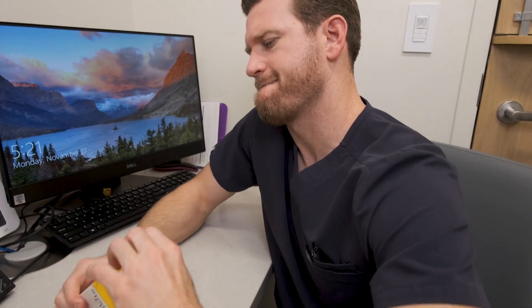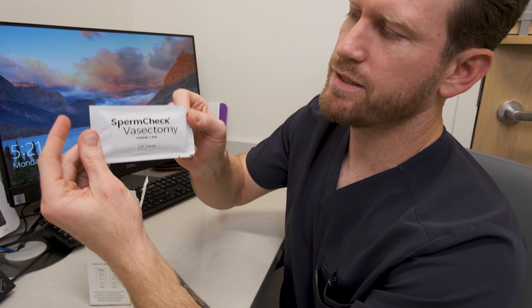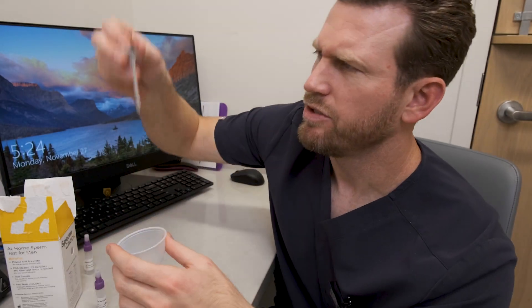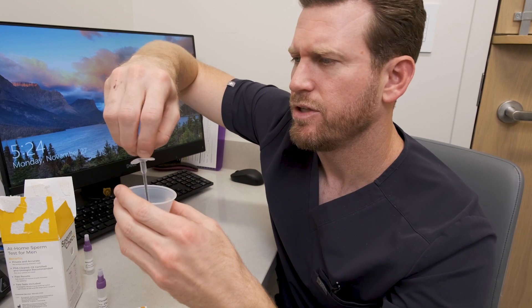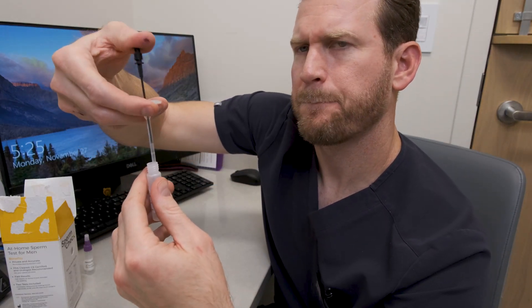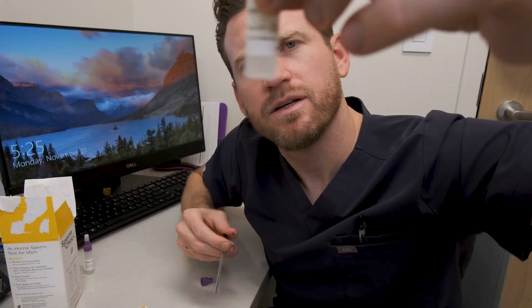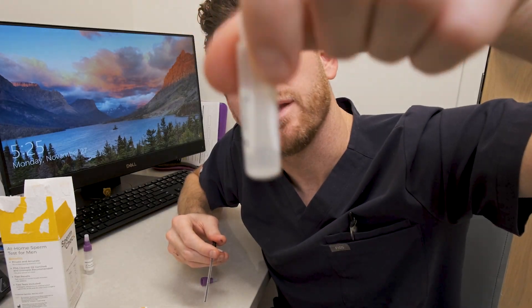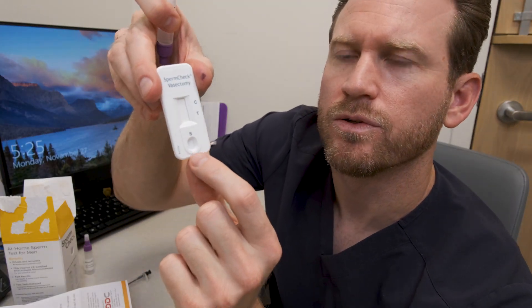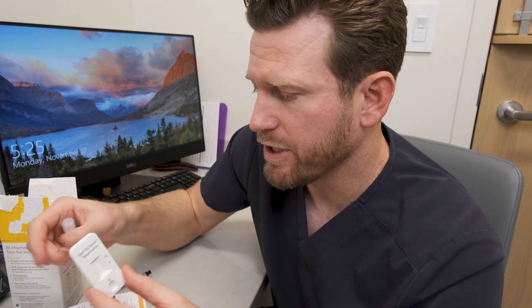Here are the kit contents: collection cup, a small syringe. You collect your sample, pull it up with the syringe, and inject it in. There's a little bit of solution in there. You add five drops into the bottom oval well, wait seven minutes, and you get your result.